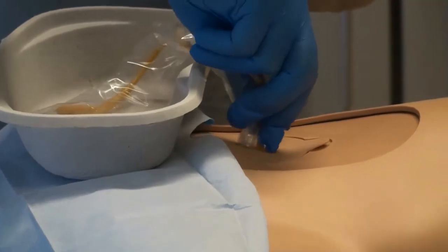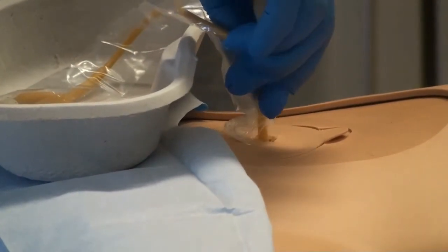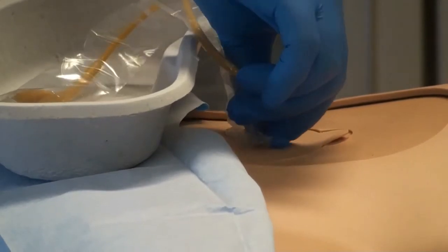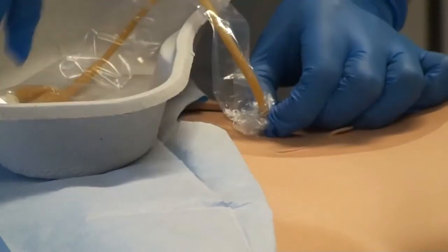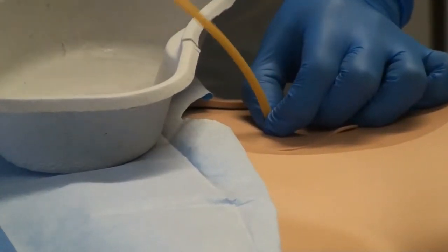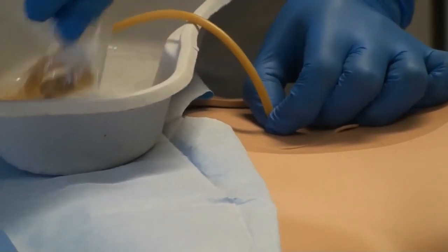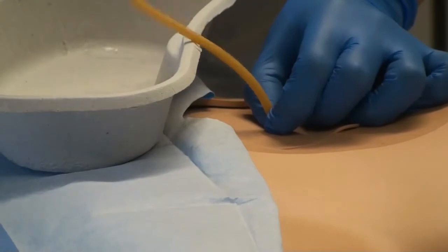Slowly introduce the catheter into the suprapubic channel to the bladder, to the distance judged by the old catheter, then advance a further 3cm. Secure the catheter and remove the outer packaging — this may be torn along the length, dependent on the outer packaging and catheter type.